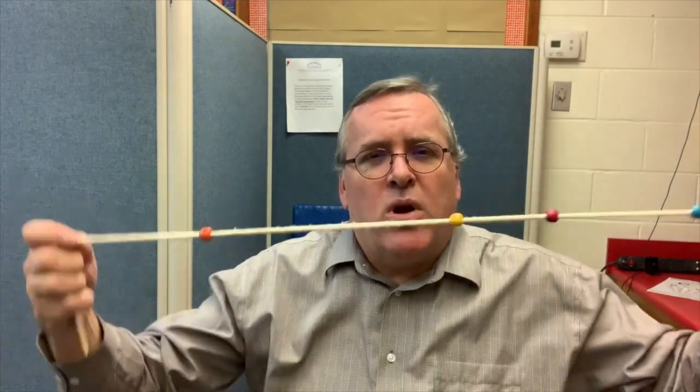The Brock string uses a phenomenon called physiologic diplopia, which is the idea that your brain can only focus on one point in space at a time. When your eyes are focused on that one point in space, anything in front of it will appear doubled, and anything behind it will also appear double. This is how we use a Brock string to help with convergence.